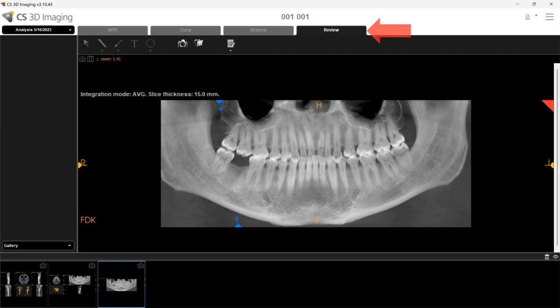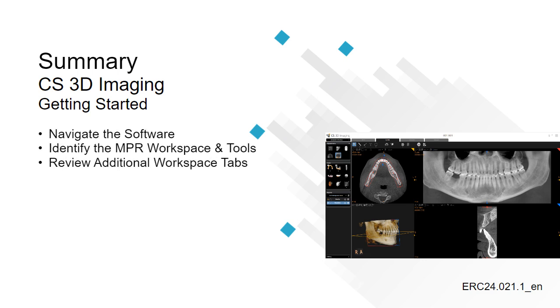Lastly, under the Review tab, you can review TIFF, JPEG, PNG, and DICOM snapshots and slices that were generated with the cross-section tool before printing them. The views on the Review tab depend on the type of images displayed. This concludes the CS3D Imaging Getting Started recorded class.